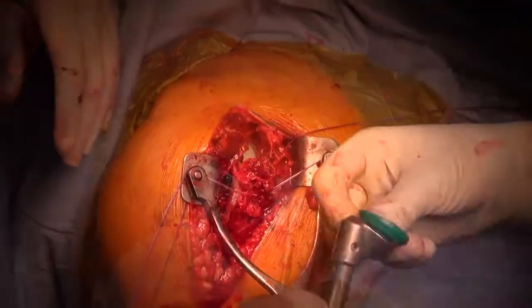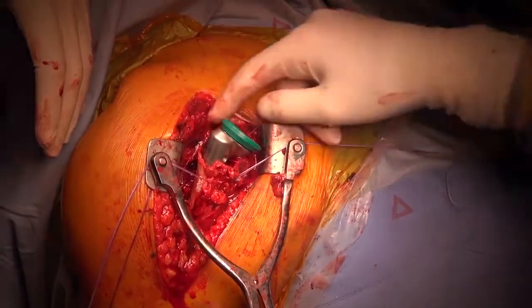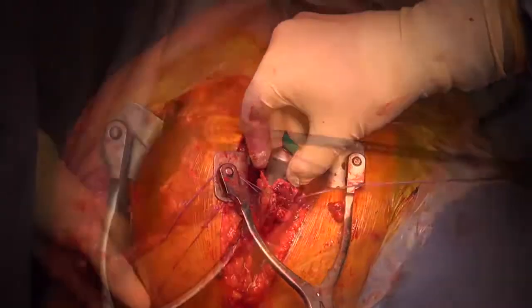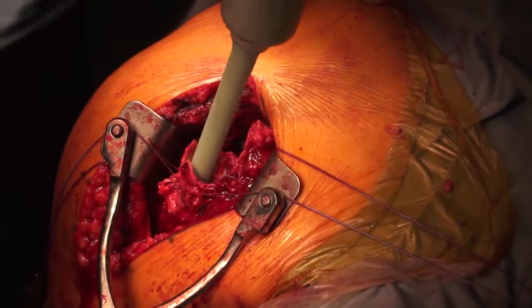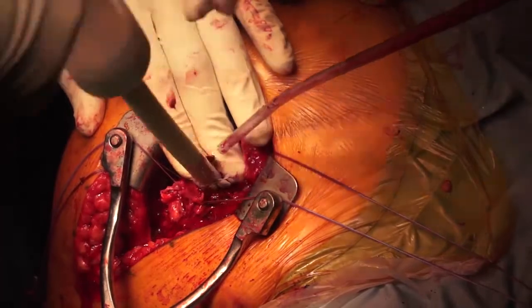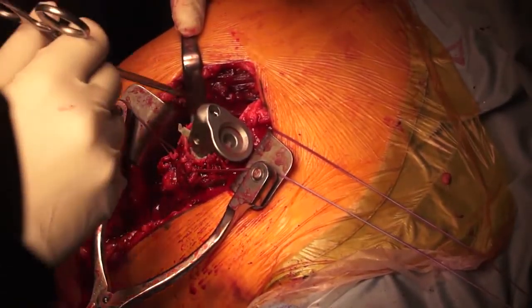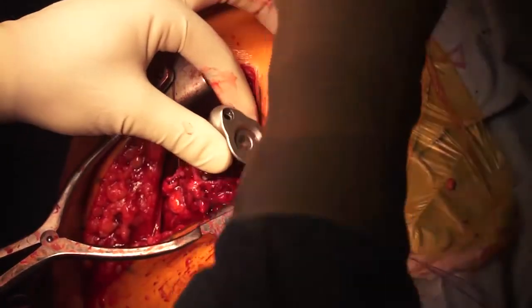Temporary connection of the inverse trial central component to the stem for evaluation of the soft tissue tension. Implantation of the cement restrictor plug and bone cement. The prosthesis stem is inserted. The rotation can be determined later. Removal of the excess cement. After cement hardening, the trial central component is removed.